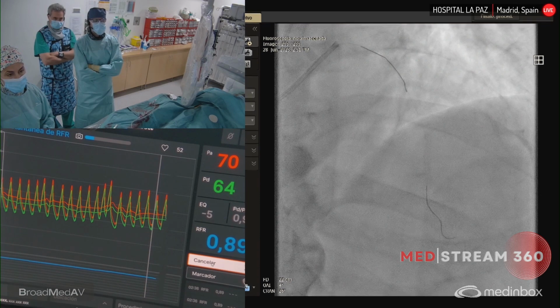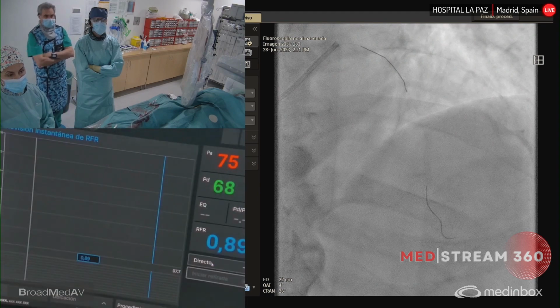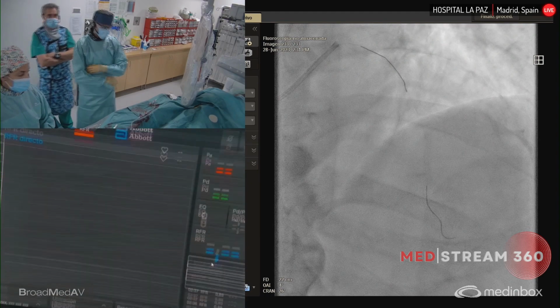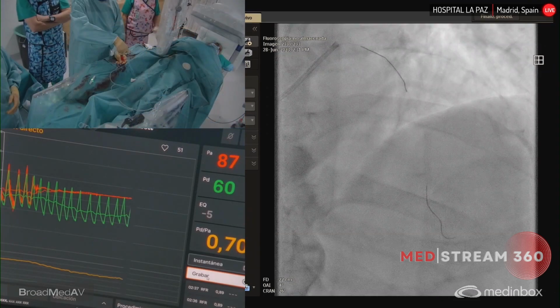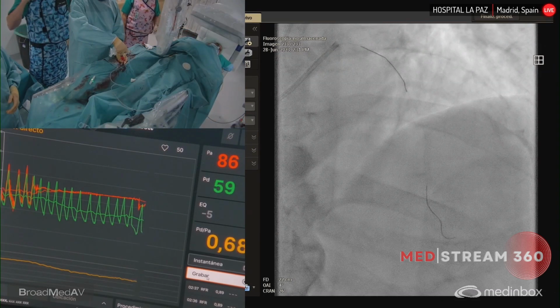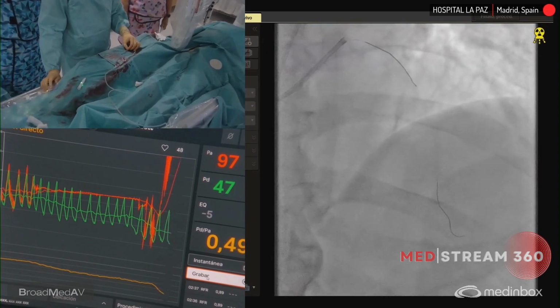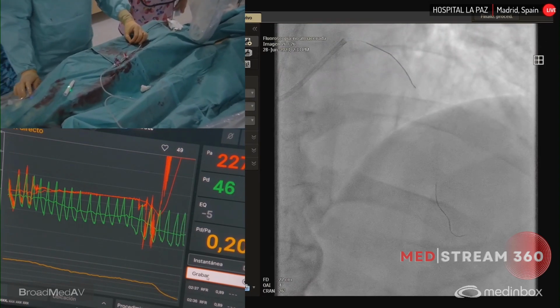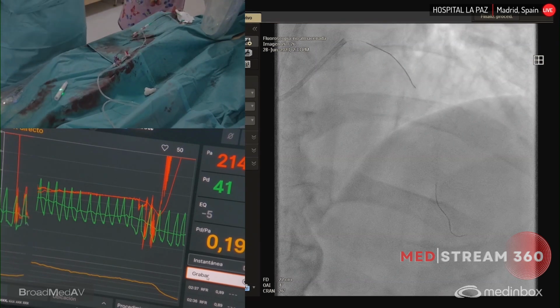We are doing FFR again with adenosine, just to show you the discussion we have had before, Santiago and me. And then we will do the OCT. And what do you think, Alfonso, about when you treat probably lipid-rich plaques, and after stent you induce some distal embolization?